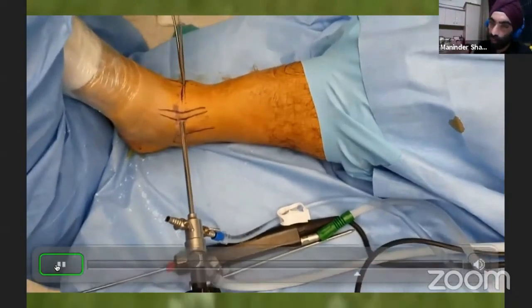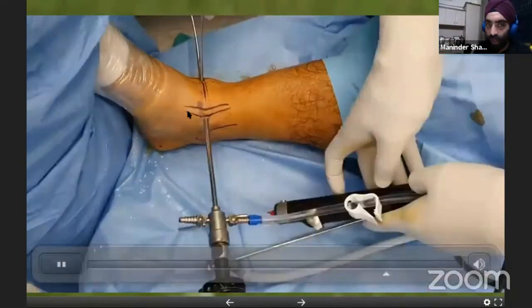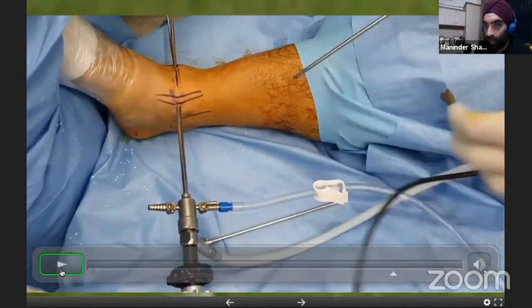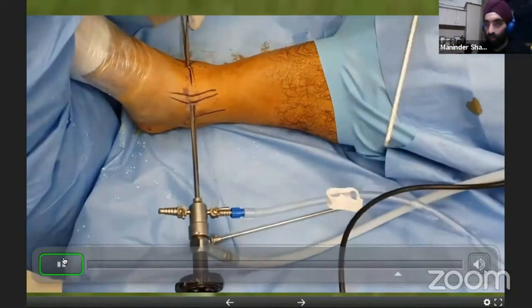From inside the joint, avoid any visible vessels when making your lateral portal. We dorsiflex the foot using the abdomen whenever putting the scope or instrument inside — dorsiflexion relaxes the anterior ankle and creates more space. The main difference between ankle and knee arthroscopy is the very limited space in the ankle. You sometimes need smaller instruments, and often have to withdraw the scope to insert the shaver — that is the main learning curve of ankle arthroscopy.